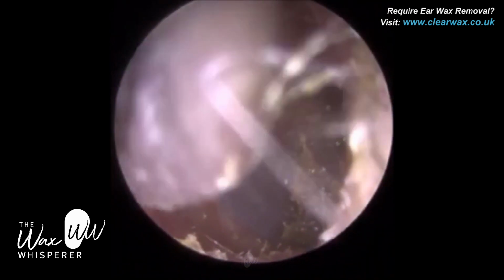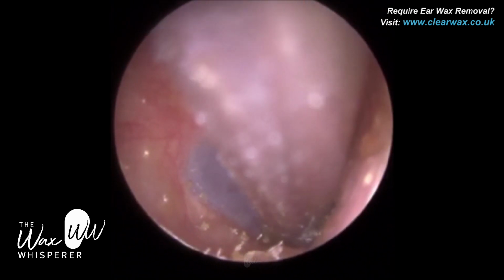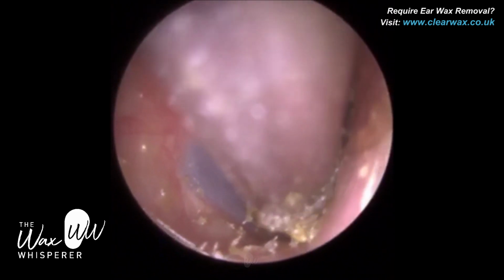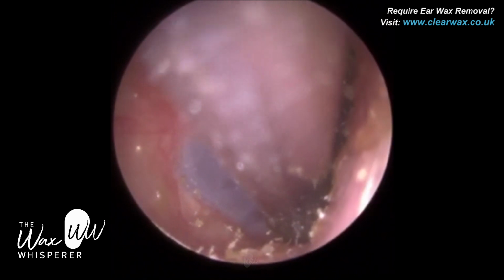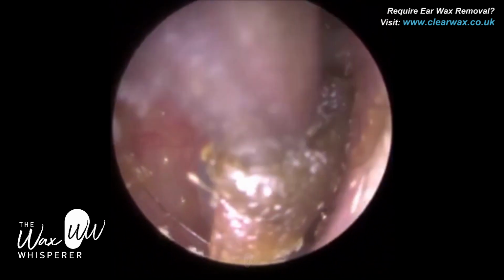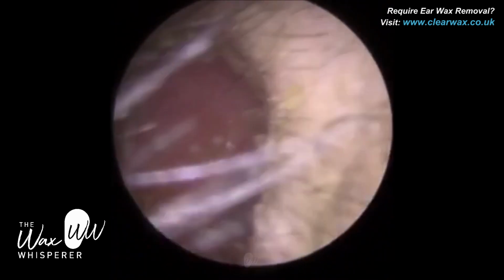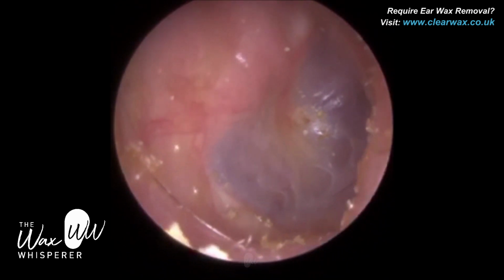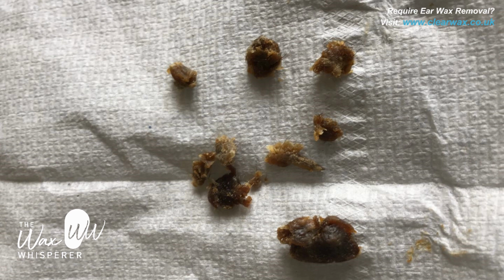Fortunately, with an endoscope, we're privileged to have the view of it. Sometimes with an otoscope or a microscope, the view of the anterior recess may be restricted, but with an endoscope and with an endoscopic approach, it just gives you a wider field of view. And you can see at the moment I'm just working the inferior recess. I just lifted the wax up and then to the left away from the anterior recess, and there's the patient's eardrum, all intact. Slightly red because the ear canal, the wax was really embedded, it was compacted.